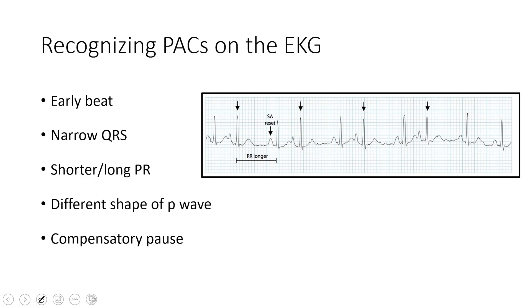So if we look at this example — this P wave, how it marches out, is probably our baseline rhythm starting from the sinoatrial node. But if you look at these other beats, here's an oddly shaped P wave with a different length PR — this is our special P wave coming too early. The P wave is a different shape, the PR is a different length. And sometimes if they happen too early, it takes a little bit longer for that sinoatrial node to reset, so you may see a bit of a pause after a PAC — the pause may be a little bit longer because the whole system has to reset.